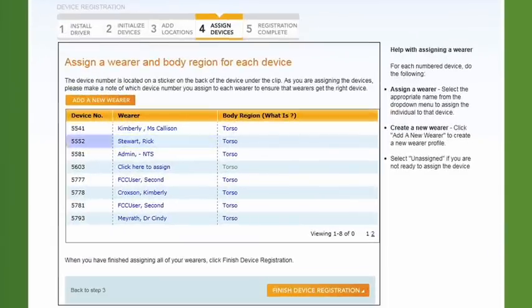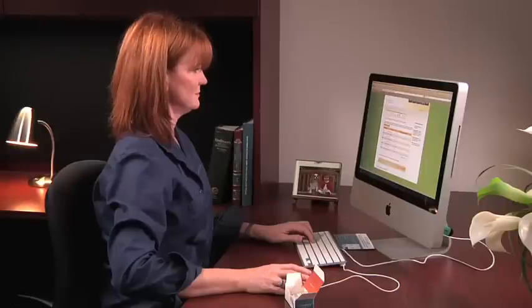Be sure to make a note of which device you assign to each wearer and provide them with their username and password so they can activate their AMP account. Once you're finished assigning devices, click Finish Device Registration to proceed to the final step.